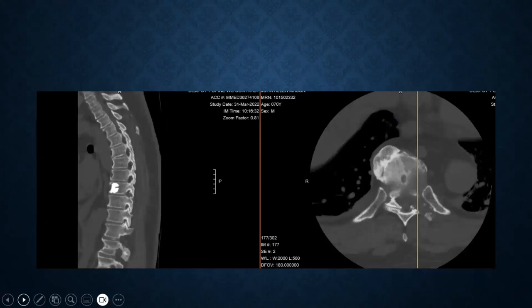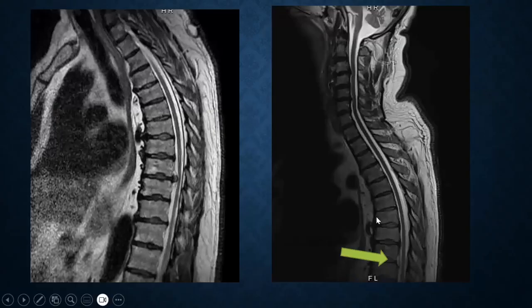And this is a post-op scan that shows how much bone was reamed or drilled. And you see it's very, very minimal on the sagittal scan. And then on the axial, you see that there's a lot more of the joint that was taken off. So through this 6-millimeter incision, you got this disc out and the patient went home the next day. This is a post-op scan showing that the disc is gone. So it's really a nice result.